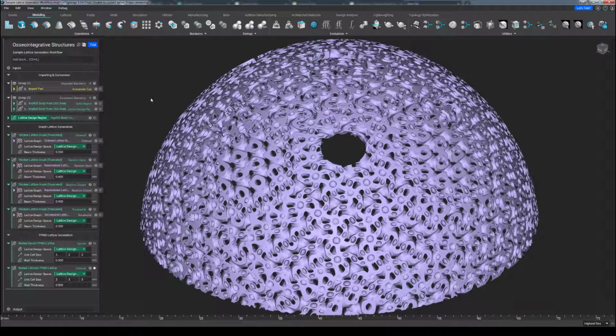From design to output, nTopology offers not just a variety of ways to control aspects of your osseointegrative lattice design process, but also a variety of ways to control where and how the design process is applied. Obviously, what I've shown you today is not intended as a be-all and end-all solution when it comes to designing osseointegrative lattices for your medical devices. There are many ways to go about this within nTopology alone, and this is merely an example on how to use our pre-existing osseointegrative structures toolkit to hit the ground running with nTopology.